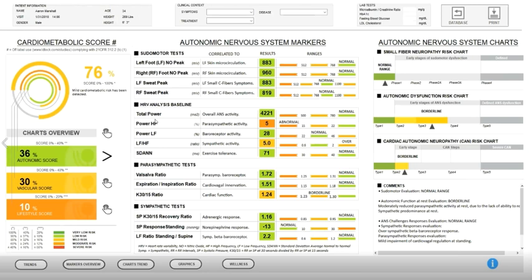Heart rate variability is basically the analysis of the heart rate, measured in milliseconds. So there are changes in the heart rate, and there should be variance. It's reflective of autonomic nervous system activity. And so the HRV is performed to give us a measure of autonomic function baseline.